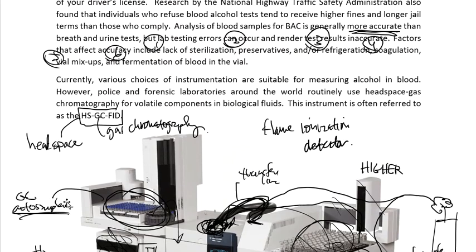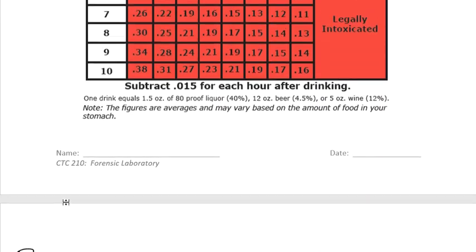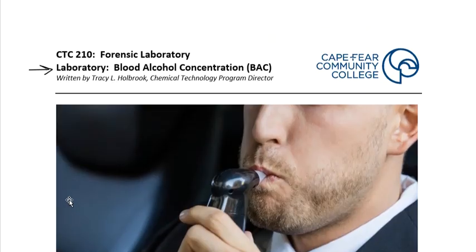So this is going to be an overnight run, and the next day we'll have data, and then we'll send that data to you, so that you can process that data on your own and have this information ready to be turned in on the next lab period. All right, so a lot of stuff going on, but good luck on the pre-lab questions.